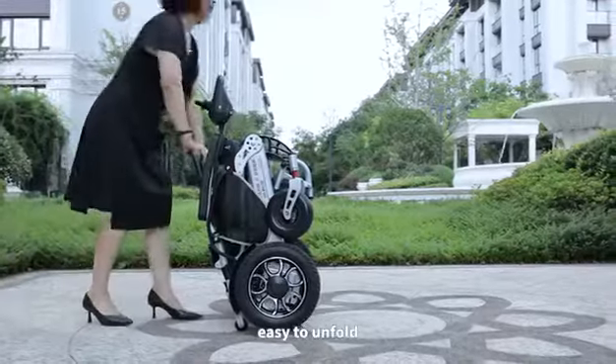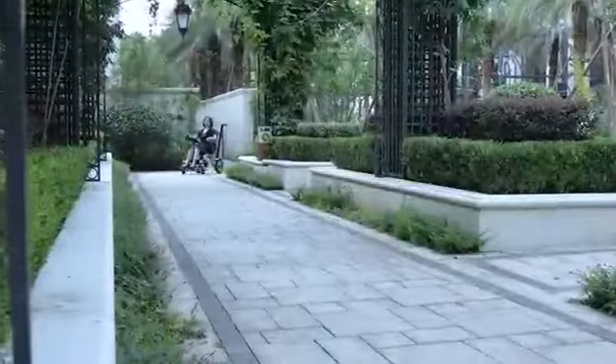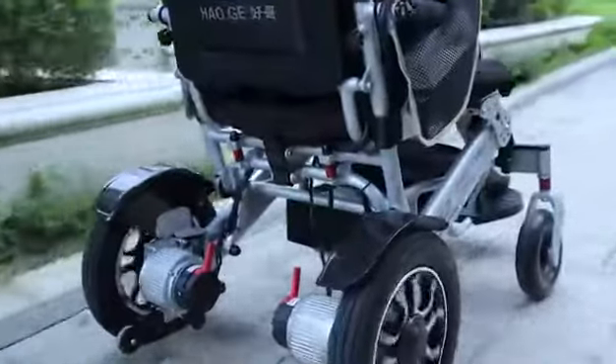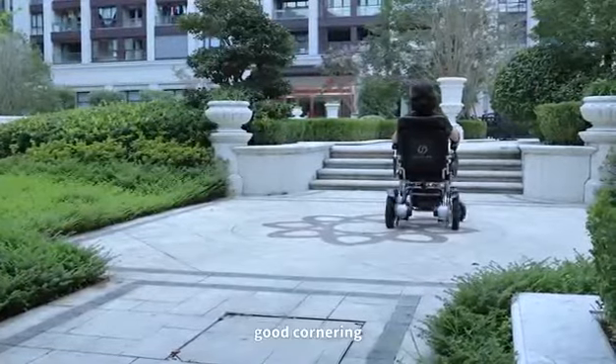Easy to unfold for quick setup. Offers smooth driving performance and good cornering ability.